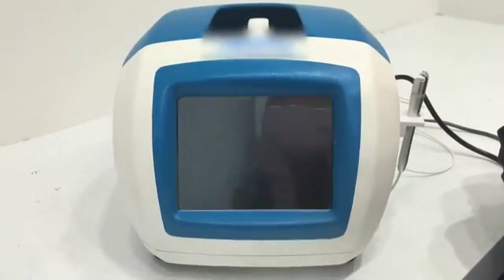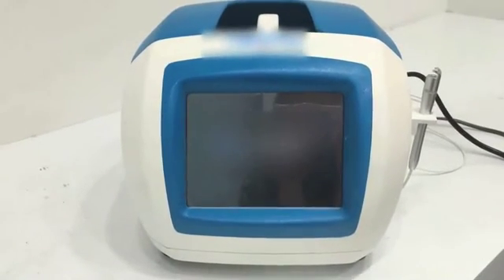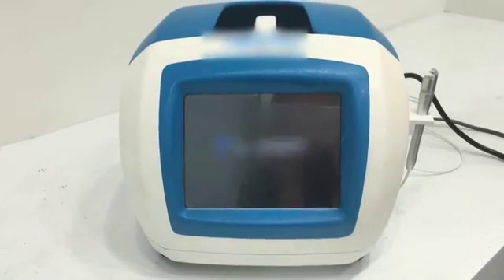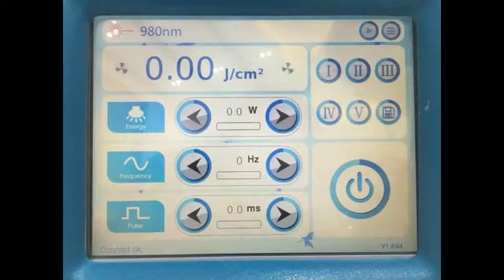Opening Interface. There will be an opening interface after turning on the machine. After the opening interface, let us start with the operation interface.